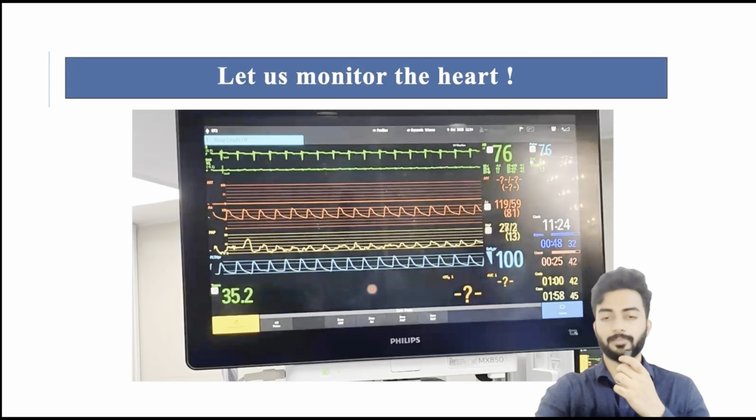So let's monitor the heart. As I have already put this image at the start also, heart rate, IBP, pulmonary artery pressure, CVP, all the monitors attached, and we have brushed up all the monitoring in this class.